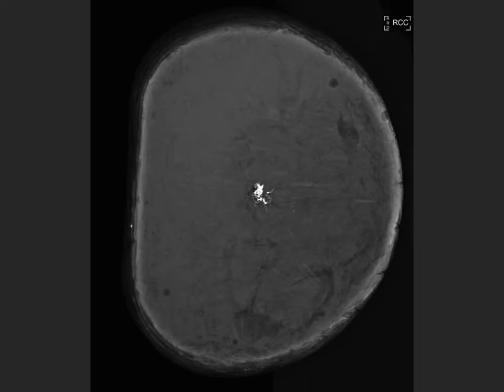Here is a radiograph of the phantom that we're going to be using to demonstrate tomographic biopsies. This is a ham with eggshells injected in the center, which you can see very nicely here.